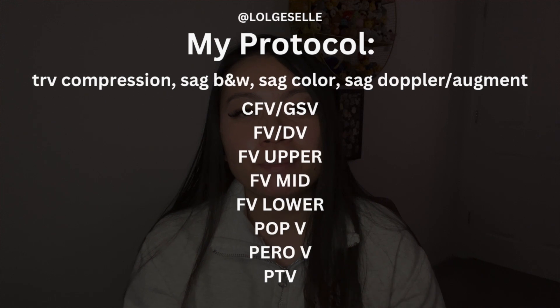I then go to the peroneals — peroneal, however you want to say it — and make sure there are no blood clots there either. I compress down the calf and go all the way down to the posterior tibial veins, making sure there are no blood clots, that everything is compressing, that there is adequate blood flow, and that augmentation confirms the vessels are clear and open.